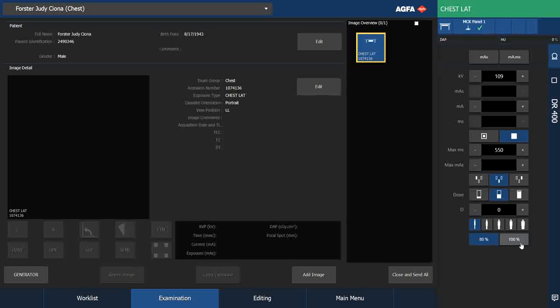The benefit is that the higher the mA, the more energy you put into the track on the anode, and in time it wears a track into it, and then in time it degrades. So this allows a simple way to stop the generator from immediately selecting the peaks of the tube file, and it extends the life of your tube.